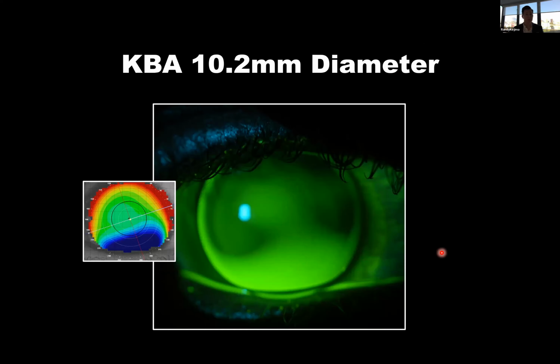Well, for this patient, because it was a 300 micron elevation differential, we were able to align the lens reasonably well. The elevation map told us that we'd have this broad, red, high elevation across about two thirds of the eye. So we see that on the fit of the lens. It's aligning across about two thirds of the lens. And then where we have our real depression in the eye surface, we see the lens vaulting.